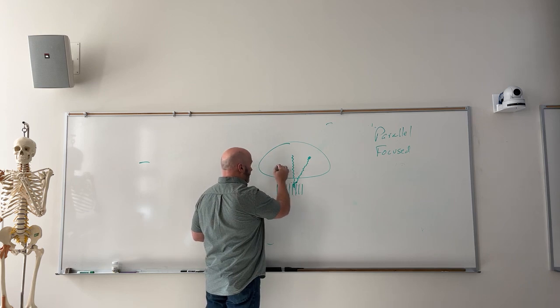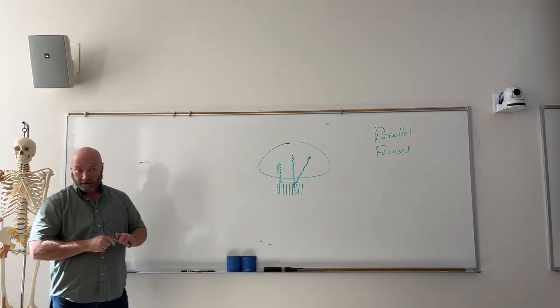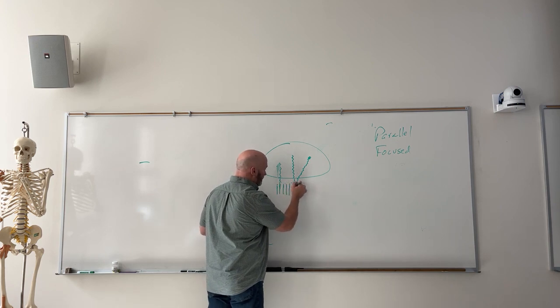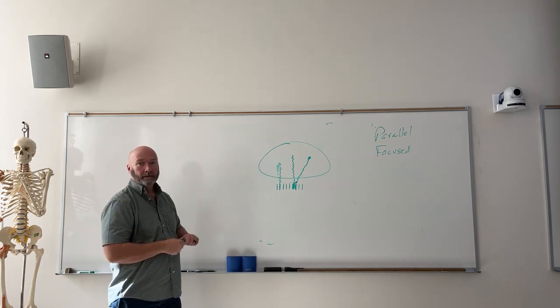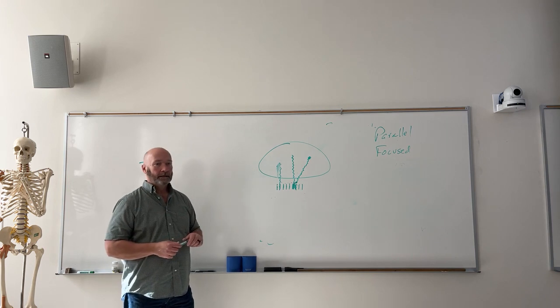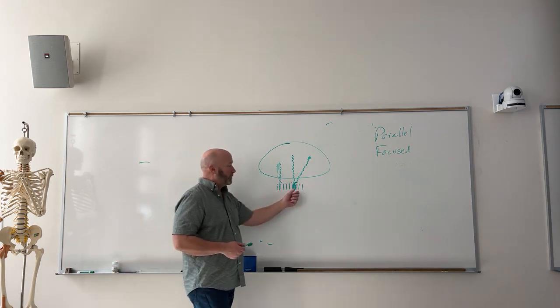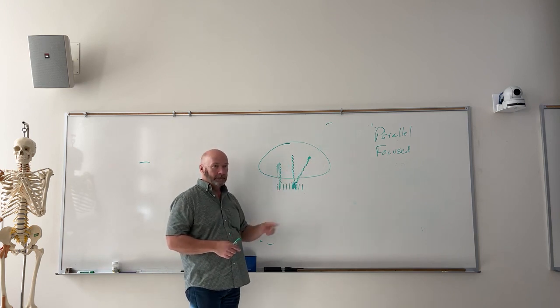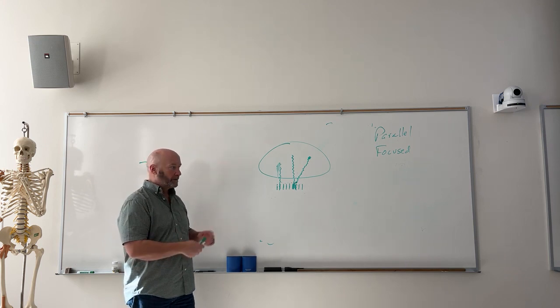Will those grid strips absorb X-ray photons that hit them? I missed completely. Hit it right on the end. Would it? Yeah, it would. So would it make it more effective if I were to take just this grid strip, and say I've got a thin grid again, and just make it thicker? It would, right? But what kind of problems would you have then? If these lead grid strips are really, really thick, what are you going to see? Not a whole lot coming through. You're going to see a lot of grid strips, right? Is that ideal? No. So what you want is you want your grid strips to be as thin as possible and spaced such that it blocks these, but it allows more of these. If you have big, fat, thick grid strips, then you're going to have grid lines. Grid lines are just an artifact, and they make your image look awful.